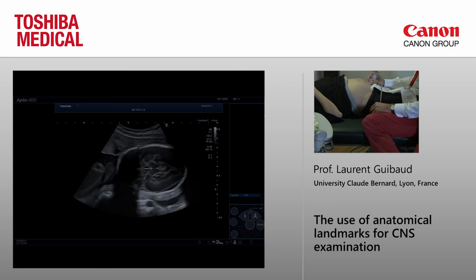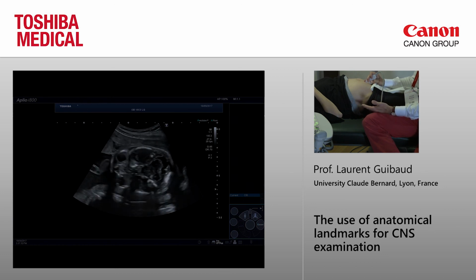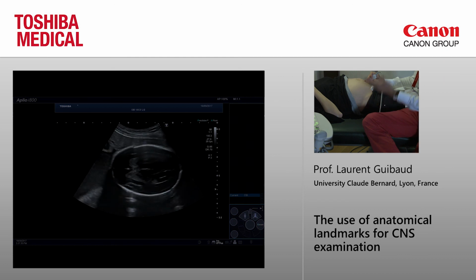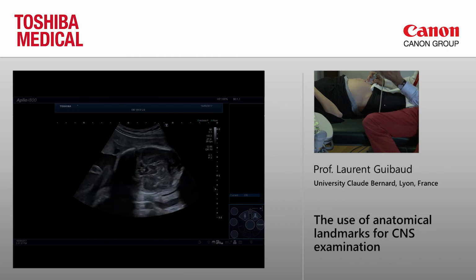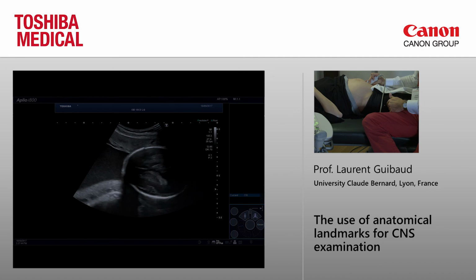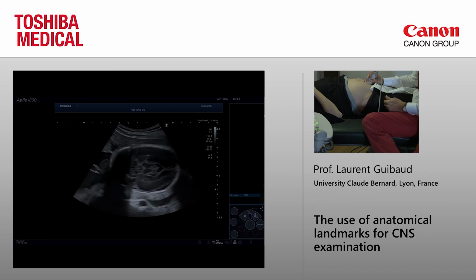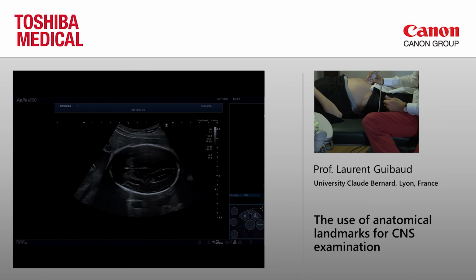But I think for me it's very important to do that in a perfect axial plane. You see, it's like a CT scan. And when we do MR, we do all this with series of axial planes. If I gave you this, you would say, no, it's not a good MR. But why? When we are scanning, we are not doing exactly the same thing. If we are precise with MR, we should be precise with ultrasound.